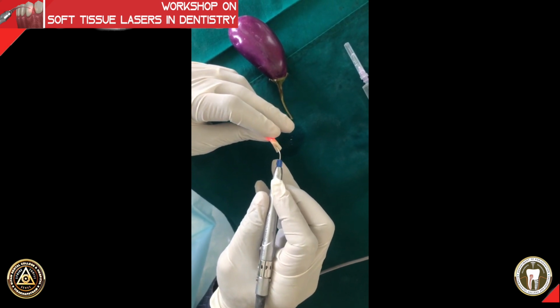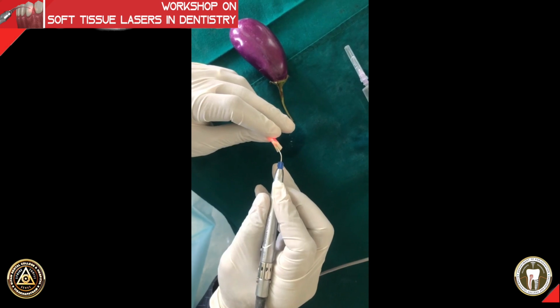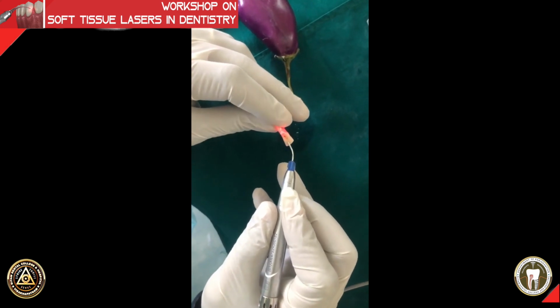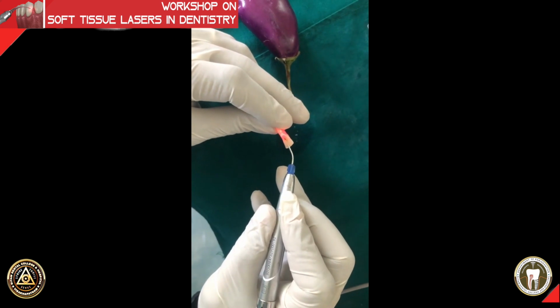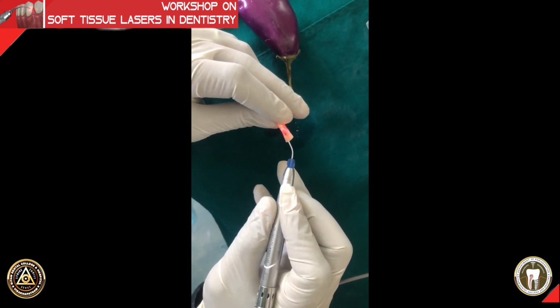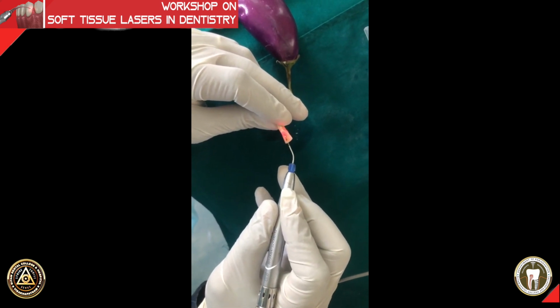This step has to be done 4 times per canal. So in a multi-rooted tooth with 3 canals, you have to do it 12 times in total, for each canal 4 times with a gap of 10 seconds. So root canal disinfection will take some time. It's not just showing something and coming out immediately, right? So that's the procedure for a root canal disinfection.